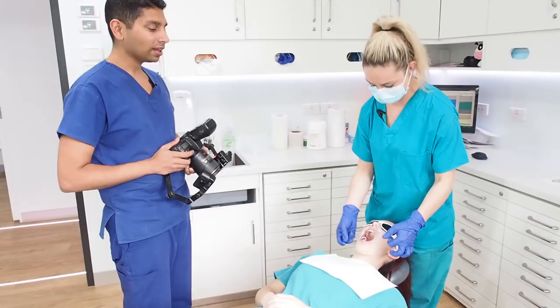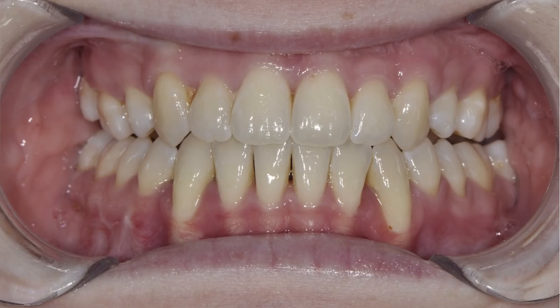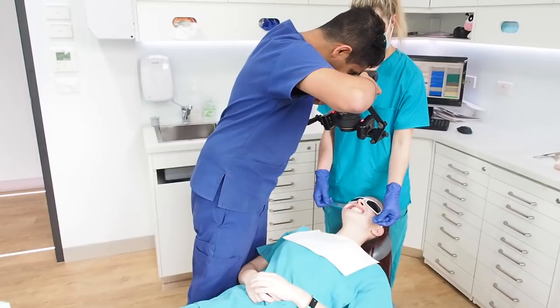I'm going to do the anterior closed picture first. Bite down together. I'm going right up and it's further forward towards the patient's nose than you'd expect. And just open slightly — that gives you the open photo as well.